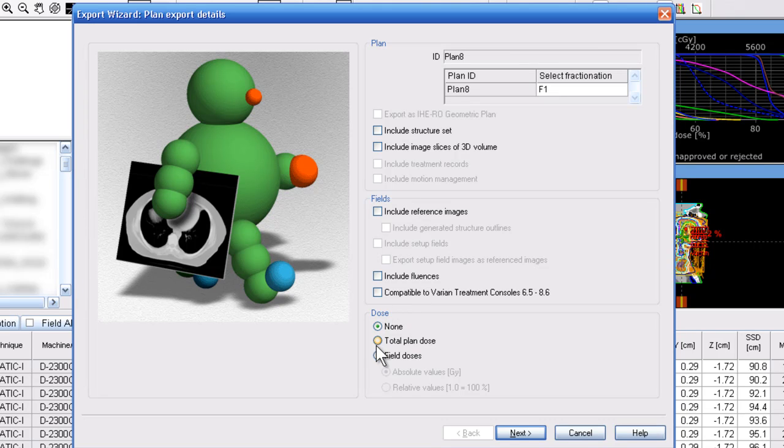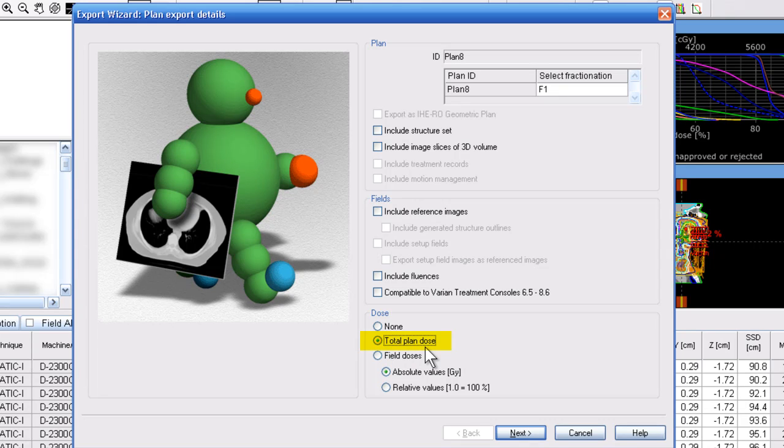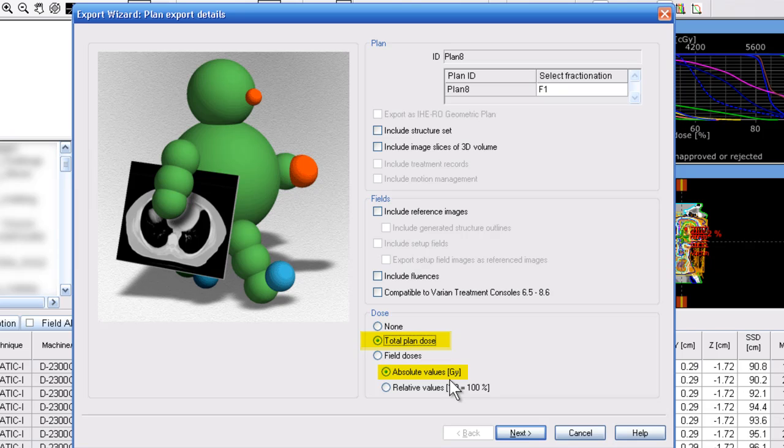The most important thing on this menu here is to make sure that the total plan dose is selected and the absolute values in gray is selected.